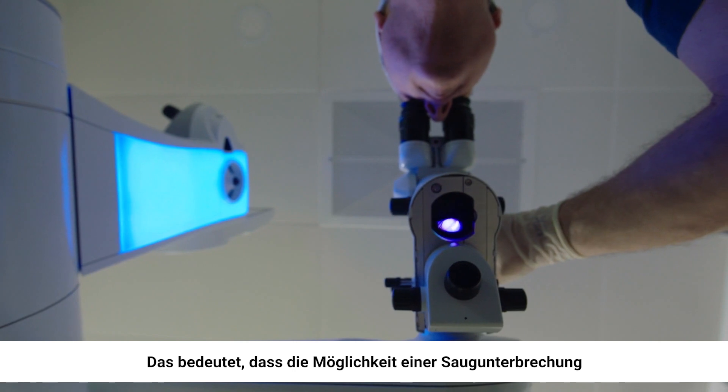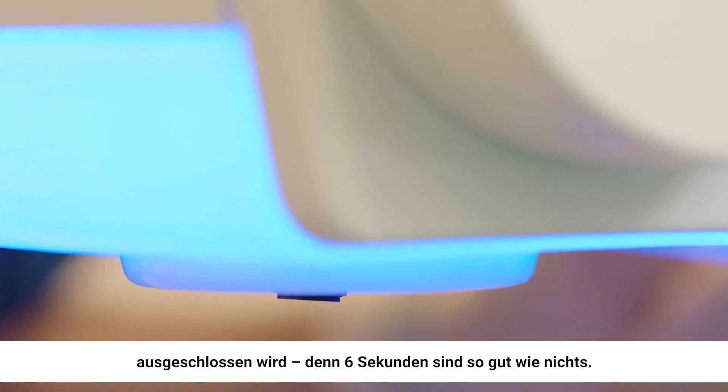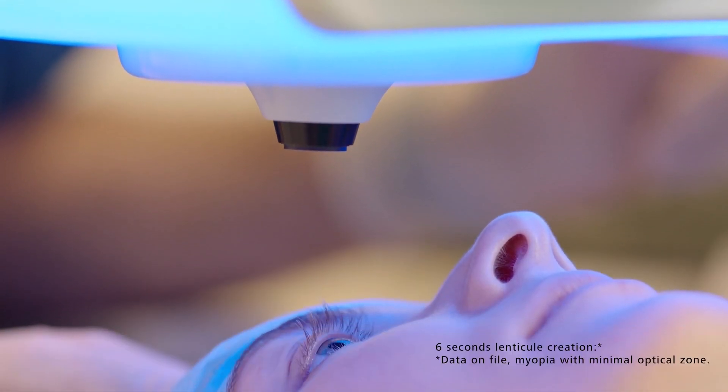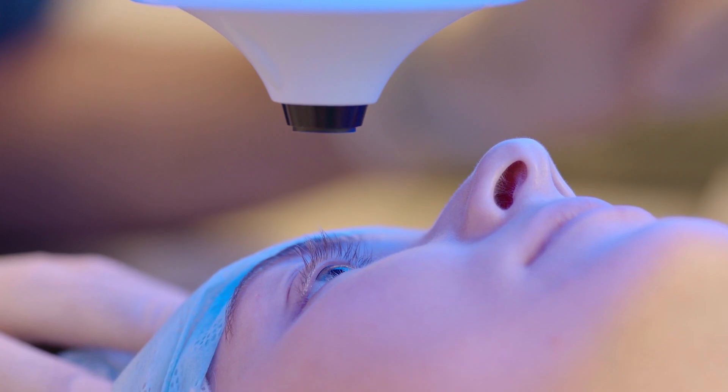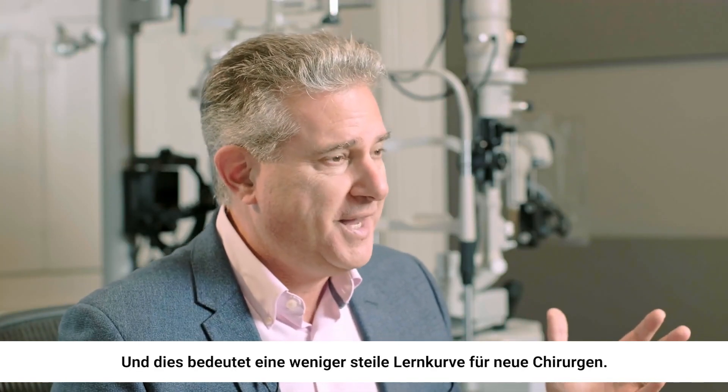It means that the possibility of a suction break or an unstable suction are eliminated because six seconds is nothing. A whole list of the complications that could occur — they're gone. And it means that a novice will have a shorter learning curve.